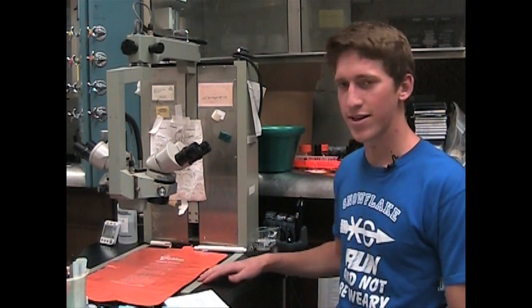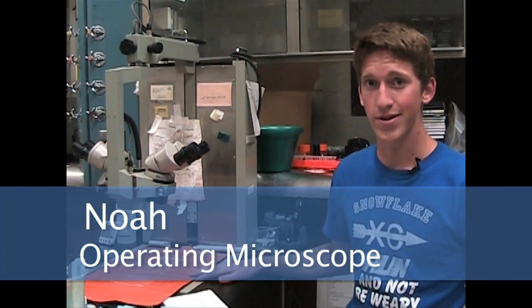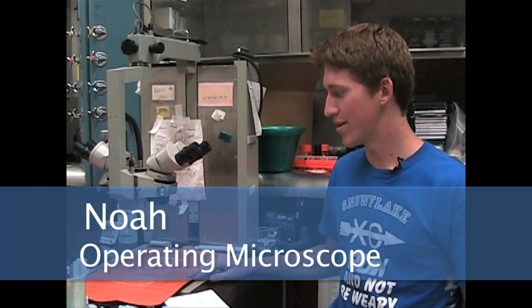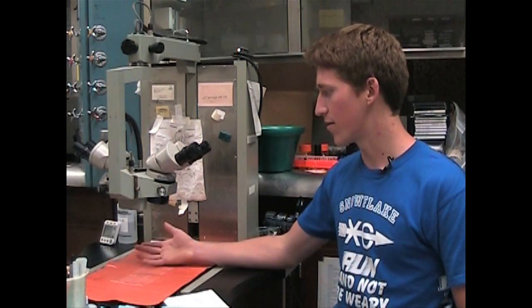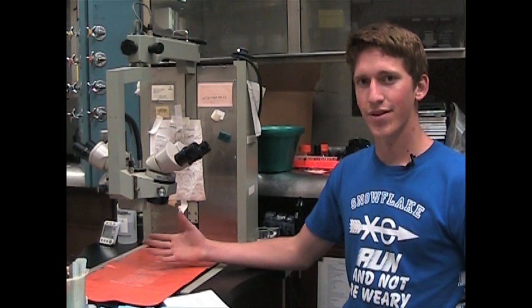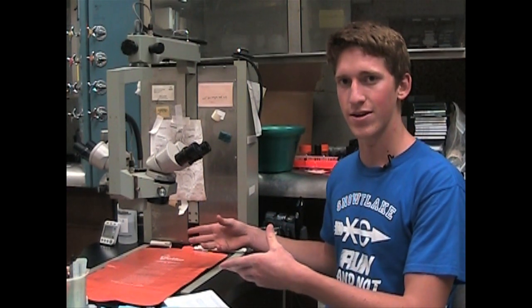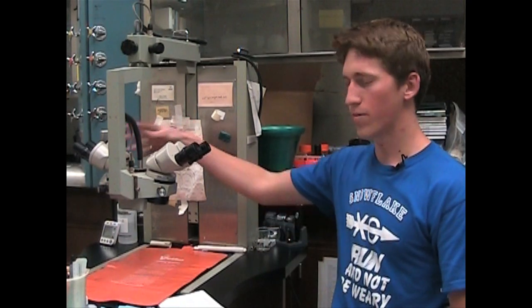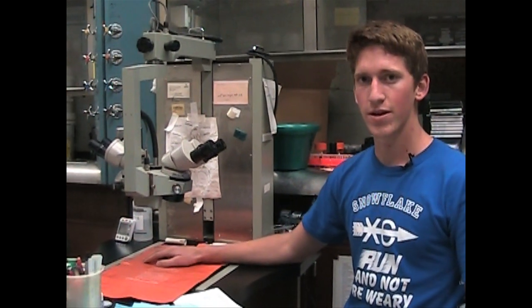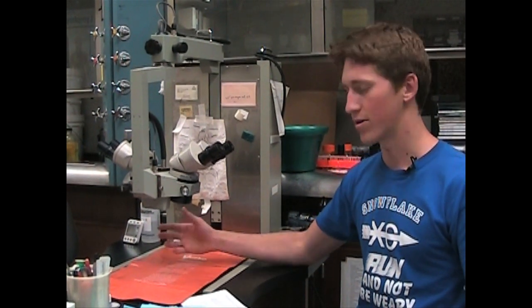This is the operating or dissecting microscope. It is used for operations or surgeries that we do in our lab. It has a lot of different things that make it easier while you are doing the actual surgery. It has two microscopes so that two people will be able to participate in a surgery, operation, or dissection.